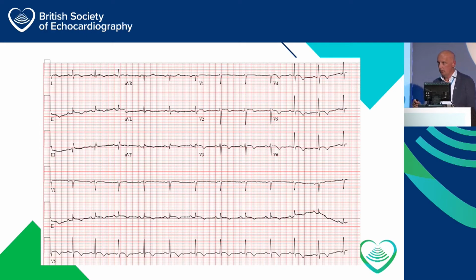450. So elevated. You can see that there's some anterolateral ST elevation. There's some T-wave inversion, certainly from V2 to V6. Some suggestion of ST elevation, T-wave inversion here, ST elevation in lead 2, just here, only small amounts.